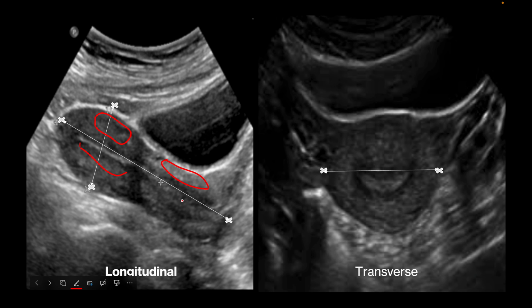We often find angulation between the uterine body and cervix. So this angulation sometimes helps to differentiate uterine body from cervix. In the reproductive stage, if you compare the length of the uterine body to that of the cervix, the ratio will be almost equal to 2:1. And in the postmenopausal stage and in the pediatric stage, the ratio of the length of the uterine body to that of the cervix is usually 1:1.